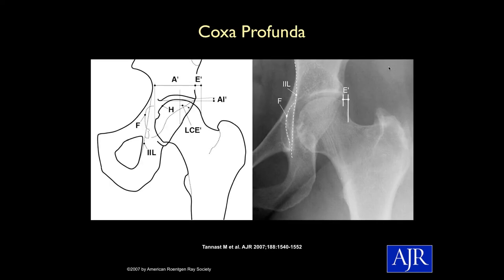Here's Tannast et al.'s example of coxa profunda, where the floor of the acetabular fossa goes past the ilio-ischial line — meaning a deep socket. There's more coverage of the femoral head, heading towards potential pincer-type impingement. Note also that the posterior wall crosses about halfway across the femoral head — that's what you expect for normal. In protrusio acetabuli, the femoral head itself goes past the ilio-ischial line, making an even deeper socket.